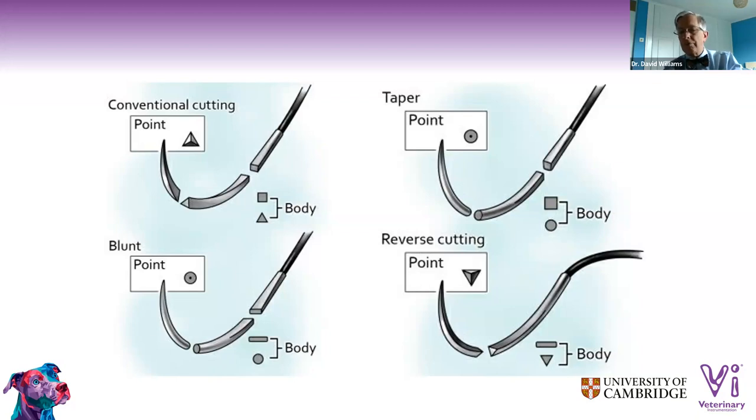It's just that if you want to make it seem that people have to refer to you, it's much nicer to have 8/0 or even 10/0 and an operating microscope. But really, a 6/0 Vicryl with a reverse cutting 3/8 curve needle should do you for everything that you need to do. Okay.